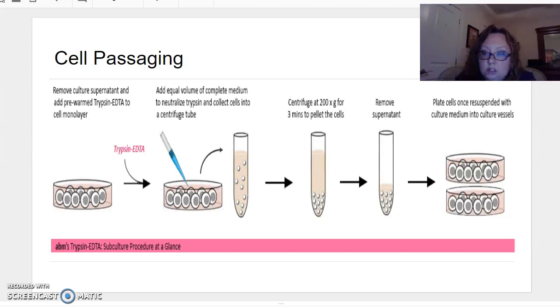This only shows 2 petri dishes. I recommend 4. Fewer cells on a flask or a petri dish is better. It lets them grow and have more space, so they can use up the nutrients in the media.